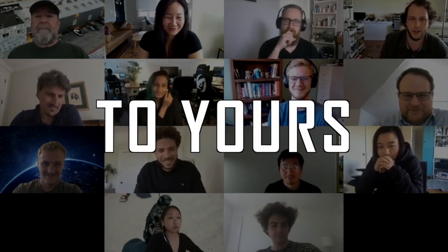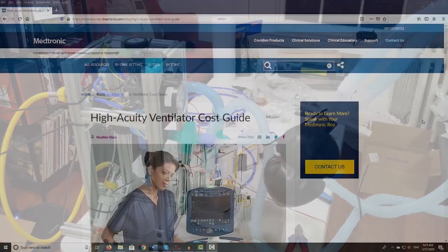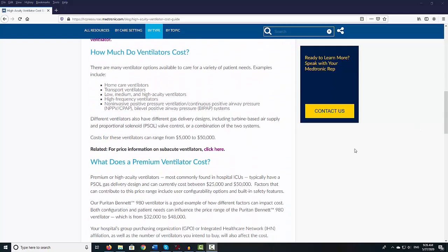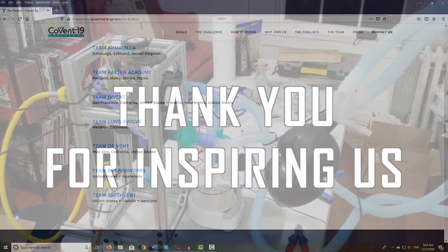Keep in mind, while commercial ventilator vendors and some car makers are now joining the race to produce ventilators, those destined for the commercial market will likely cost between $25,000 to $50,000 a unit, according to Medtronic. The aim of COVent-19, by contrast, is to produce units that can be built for around $2,000 to $3,000. So even long after the crisis, they could remain a design resource for other developing countries and underfunded hospitals.